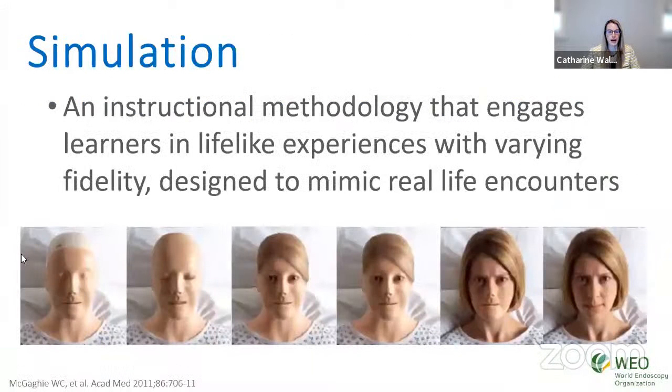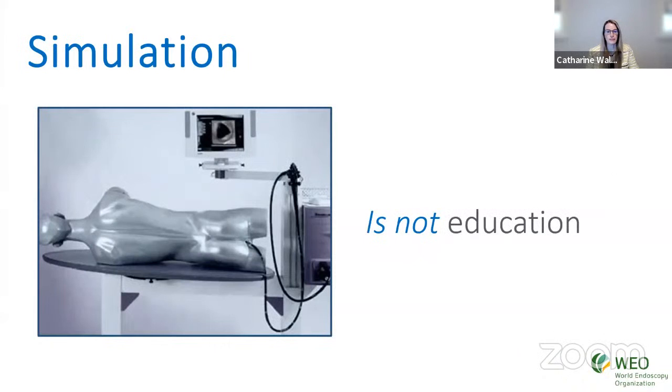Simulation is an instructional methodology that really tries to engage learners in lifelike experiences, and it's designed to mimic real-life encounters. But you have to remember that simulation in and of itself is not education. Simulation is merely a tool that enables education.